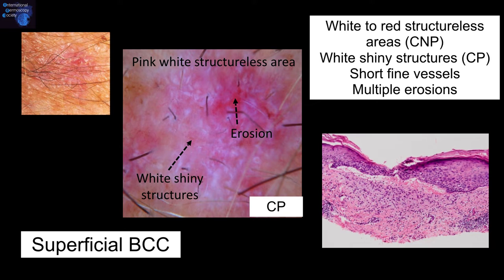Another superficial basal cell carcinoma in the contact polarized mode. Again, the pink-white structural areas, the white shiny structures often in the form of blotches and strands, and an erosion.